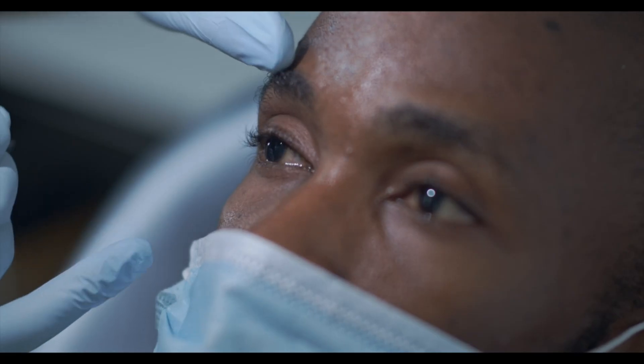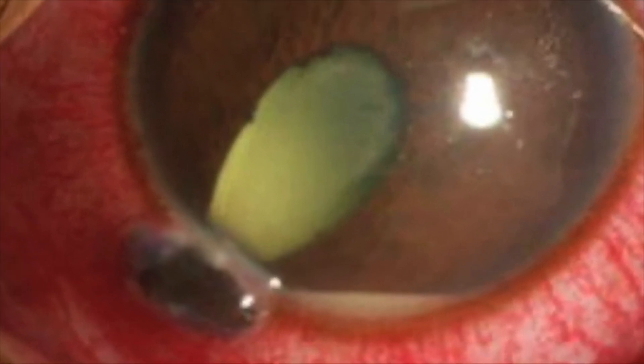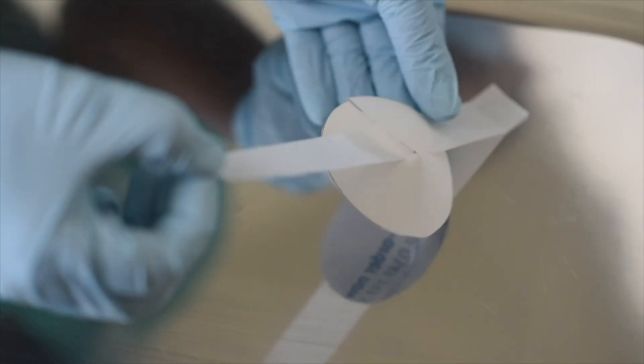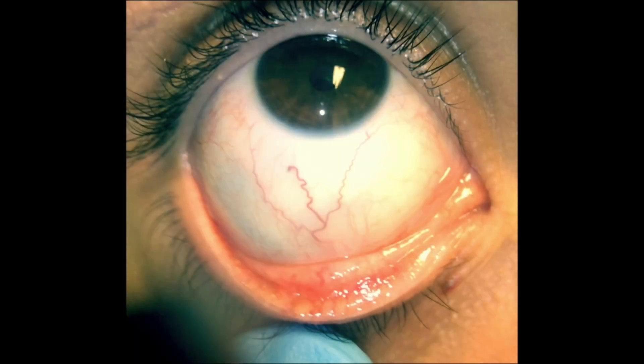Now examine the eye, looking for the foreign body, rust ring, or abrasion. If there are any concerning signs such as hyphema, hypopyon, misshapen pupil, or iris prolapse, refer to an eye specialist. Consider pain relief and antibiotics for serious injuries. If it looks like there is a penetrating injury, place an eye shield.